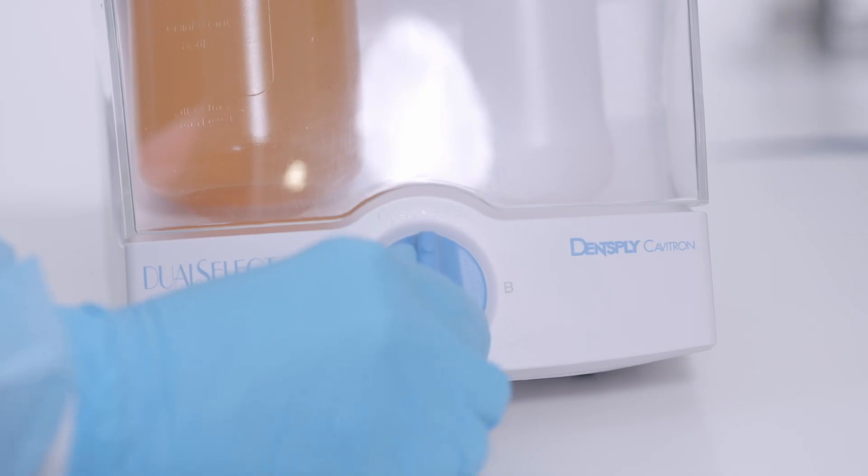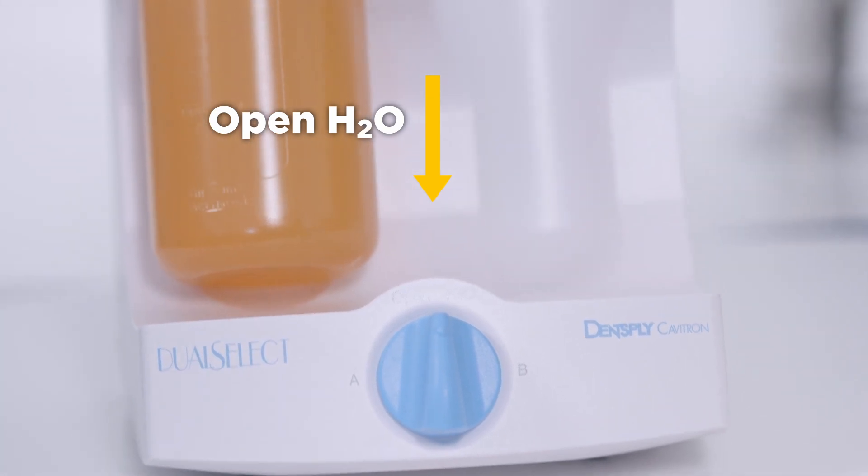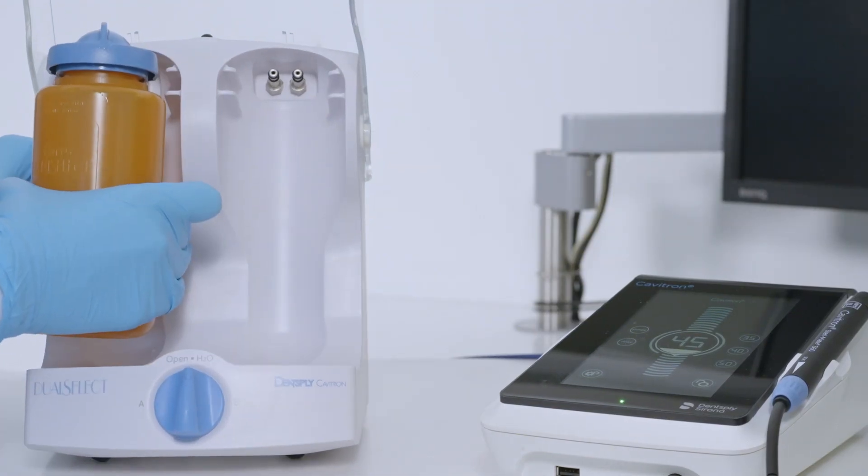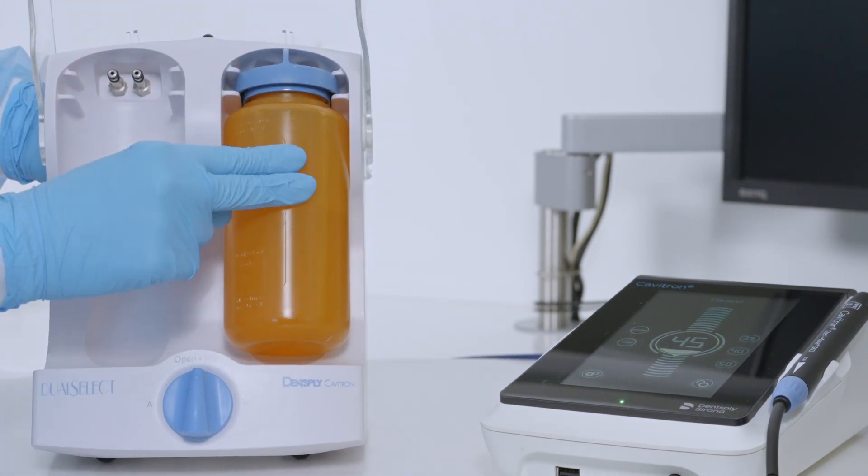Set the selector knob to open H2O position and open the shield. Remove the orange disinfectant bottle from position A and place it into position B and close the shield.